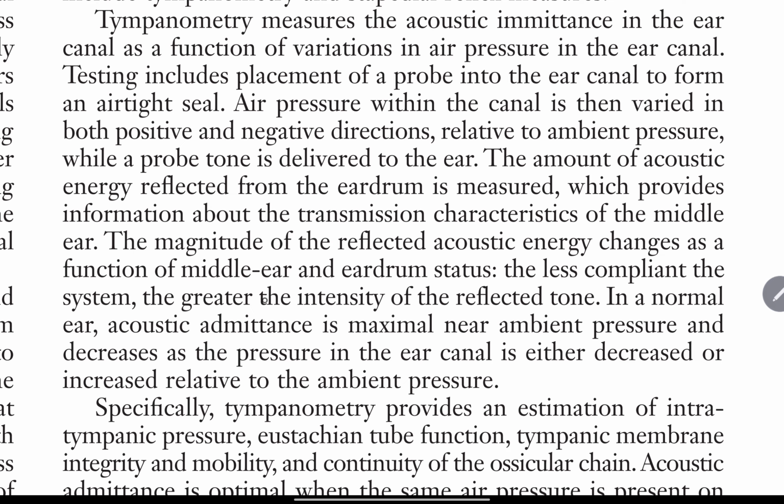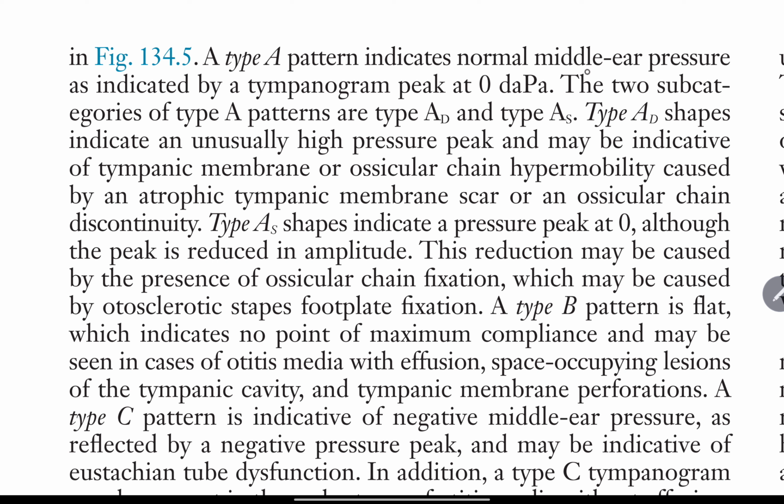This classification of tympanogram shapes is described in figure 134.5. A type A pattern indicates normal middle ear pressure as indicated by a tympanogram peak at 0 daPa.